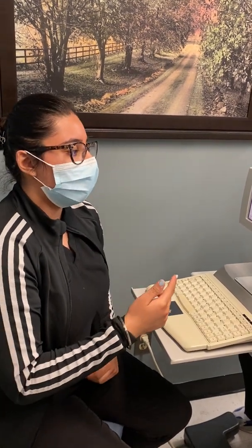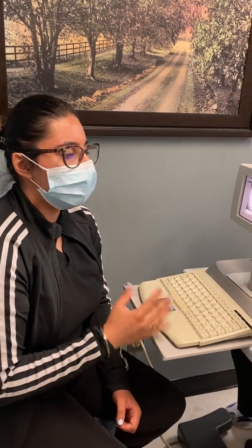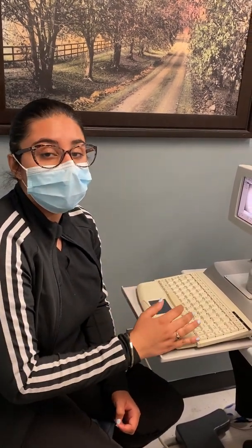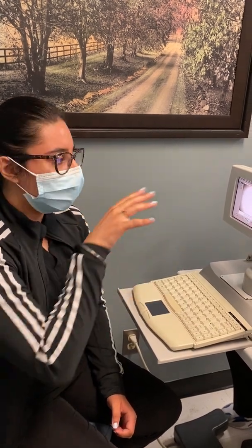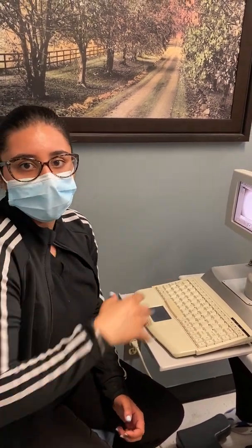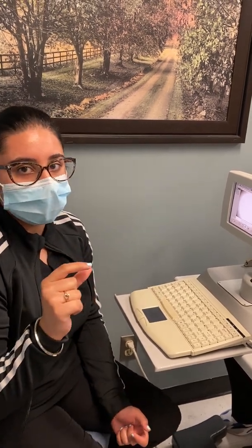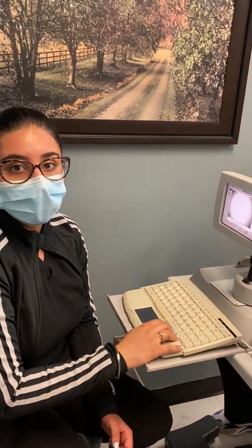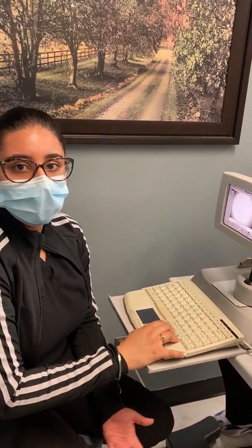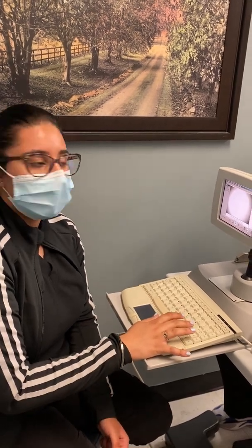If it's taking too long to get measurements and stuff, just give them a little break, because the light can really affect their eye and it could get dry. If you notice that the eyes are getting dry, you're gonna see some distortion on the screen, so you can tell that something's going wrong. Then you can put some Systane drops that we've got. They're moisturizing drops, so you can put them in their eyes and try again. Try a couple of times. If you can't get it, just get one of the senior staff members to help out. Perfect. Thanks.